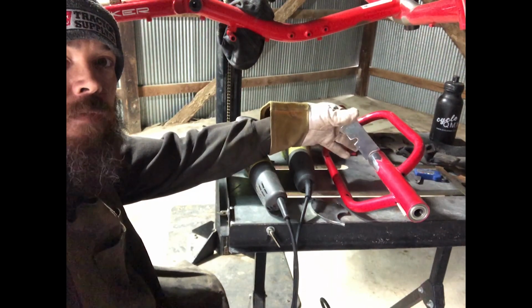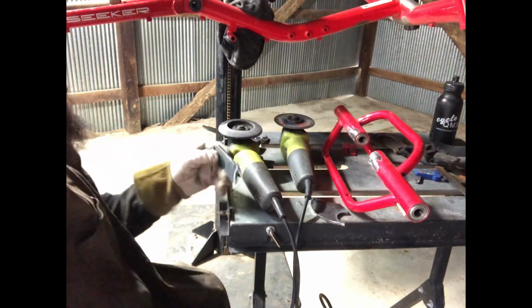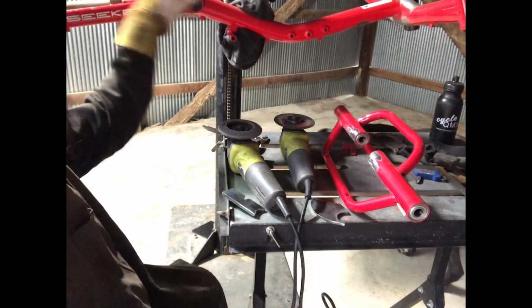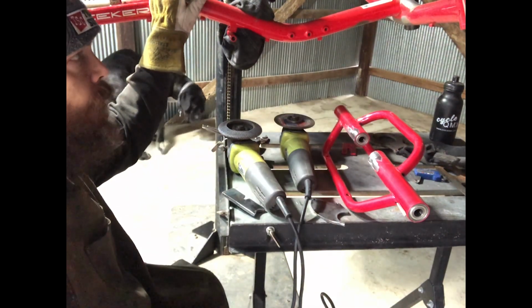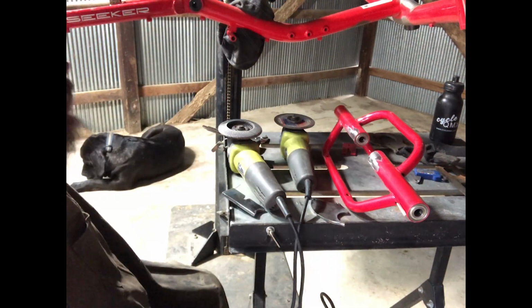Pretty simple, straightforward. You noticed I kind of shortened this up. Typically these rear ends kind of stick off pretty far and make the wheelbase on the bike pretty long. I try to keep this as short as possible to stick with the original wheelbase.